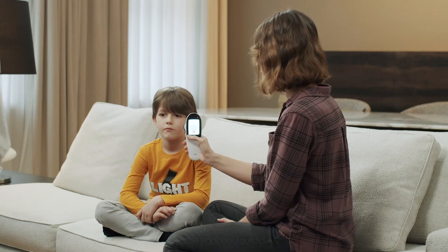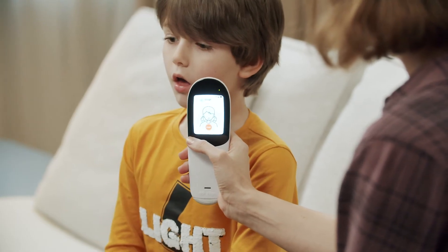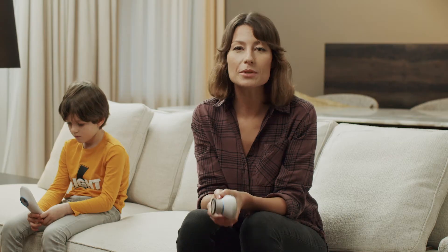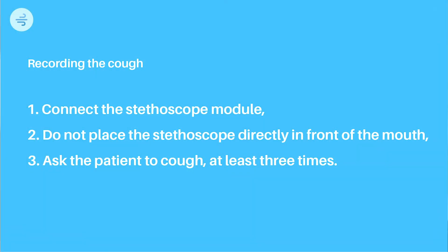Can you please cough three times for me? Keep in mind these few points to properly record the cough: don't place the stethoscope directly in front of the mouth, and ask the patient to cough at least three times.